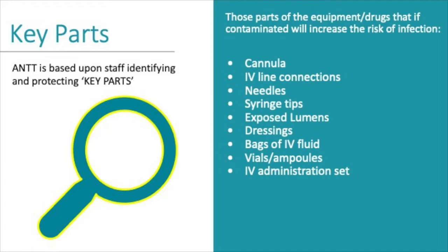So if an NA or a porter or a physio, I don't know, anyone who's not IV trained, disconnects the line and throws away that medication, the nurse who is looking after that patient may not realise that that line is not being flushed. And I will go through the importance of flushing a line later on.